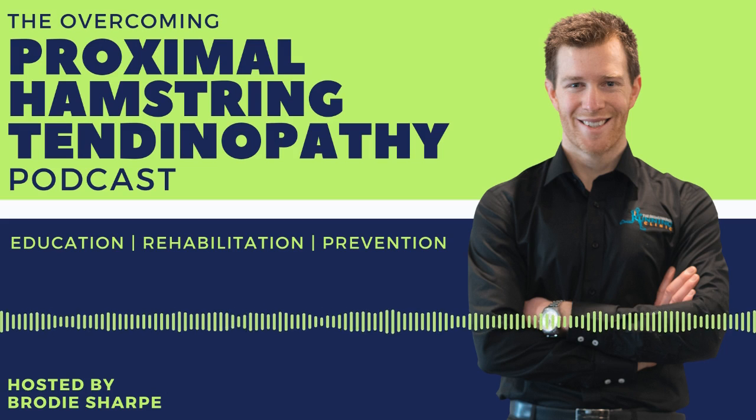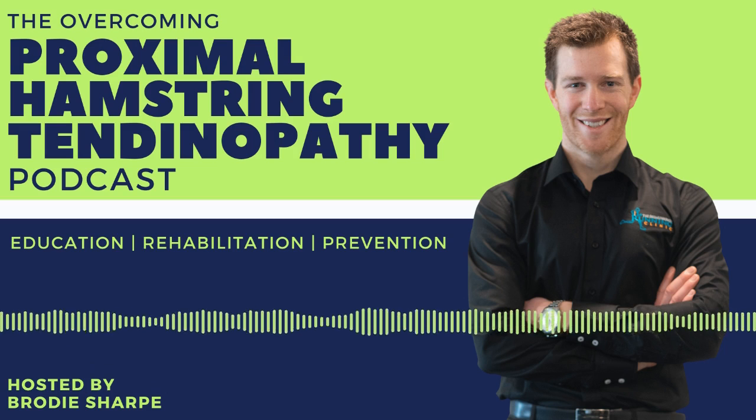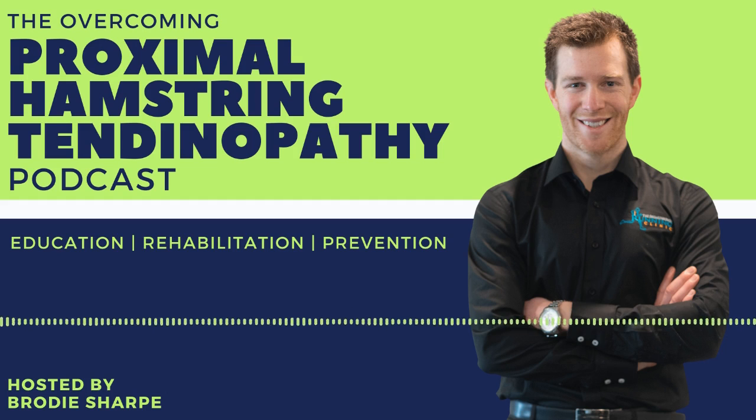If a patient has pins and needles, numbness, a bit of altered sensation, I generally don't give shockwave, because neuropathic pain and shockwave don't go well together. So it should be more like a mechanical type of pain, more like an ache. If it's very sharp, very sensitive, too sensitive to touch, then I think shockwave is just going to irritate them.